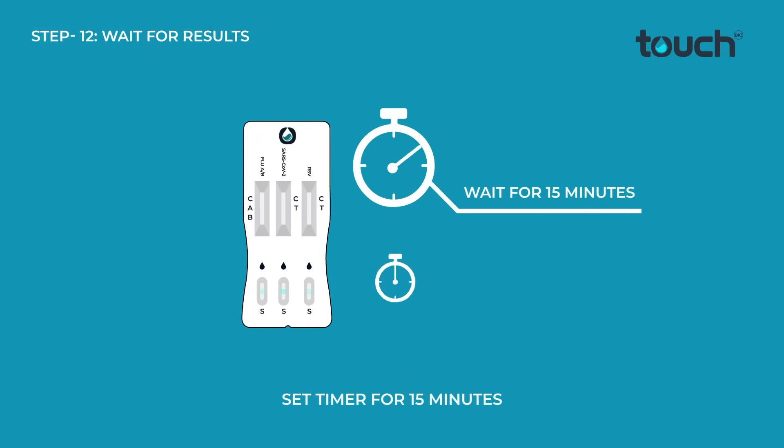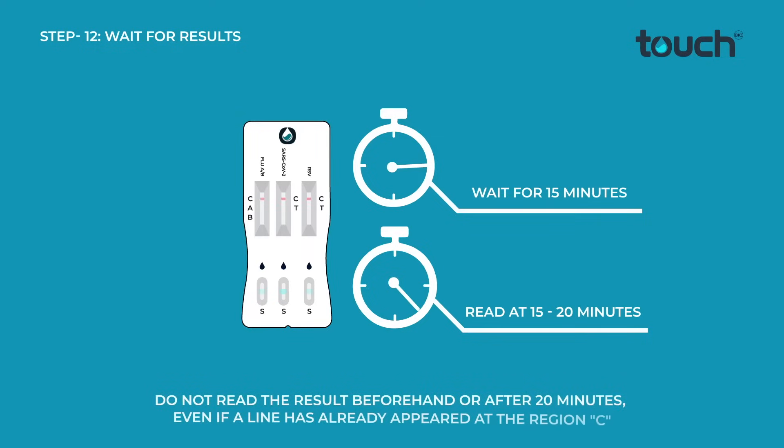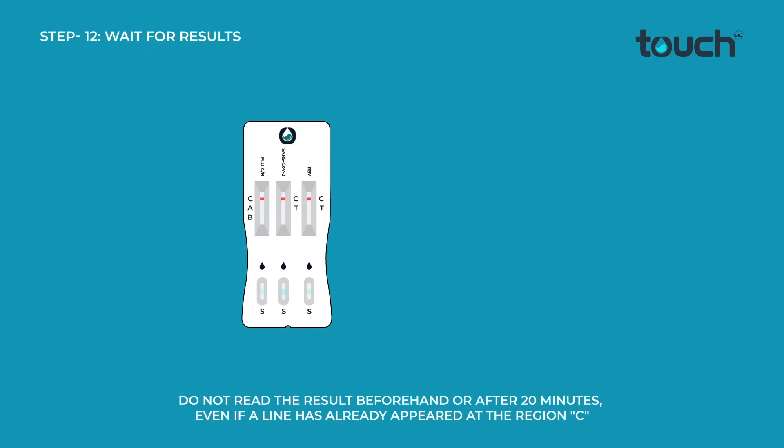Set the timer for 15 minutes. Do not read the result beforehand or after 20 minutes, even if a line has already appeared at the region C.